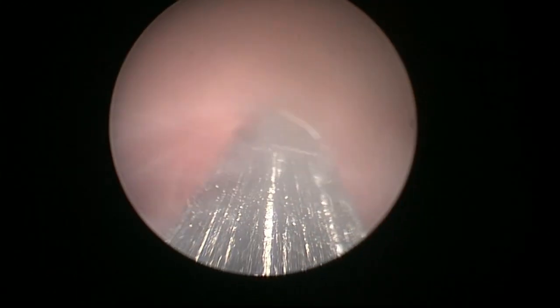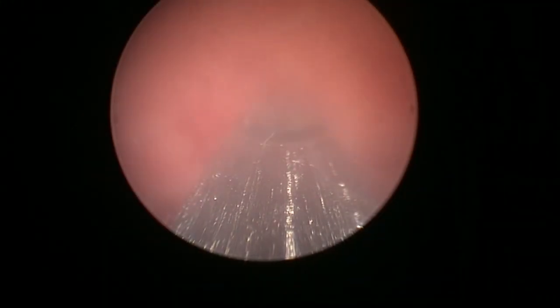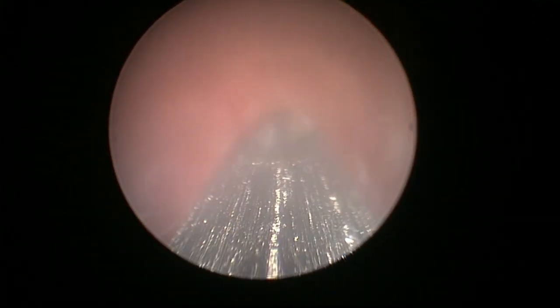But we found that there are bigger bottles in the market. So we use a 5-liter bottle. It gives us an extra amount of time that we can keep on morcellating. And nowadays, most of these glands, even when they're quite big, can be performed with one bottle only. So in this case, there's only a small remnant left. We need to check the bladder, check the fossa to see that there's no significant amount of tissue or tissue fragment. That's a small tissue fragment. And there we go. I think we finished.